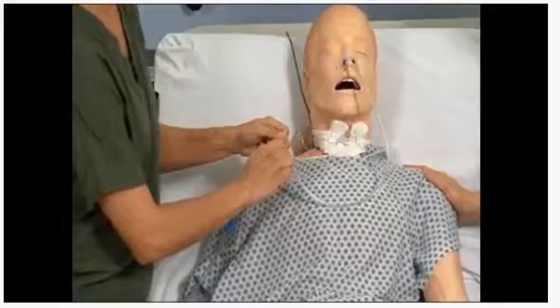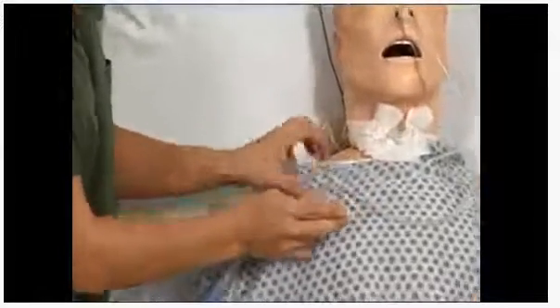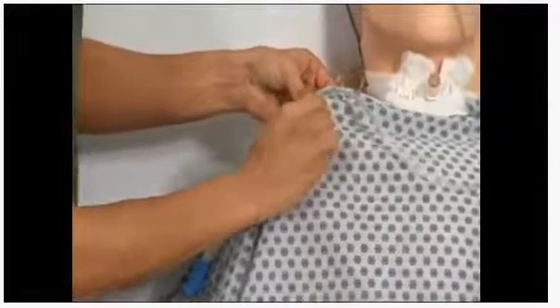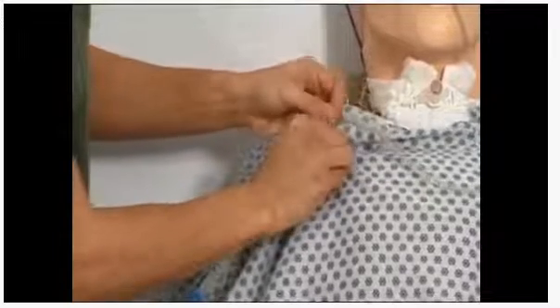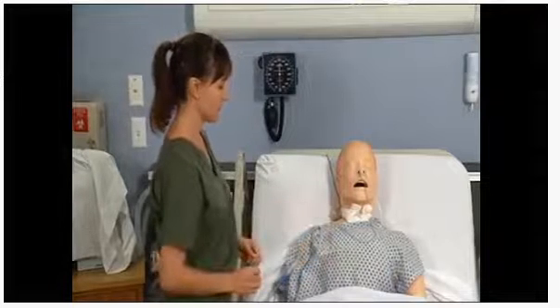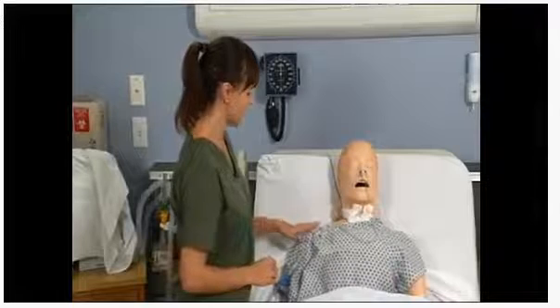And I'm going to get my safety pin, and through the tape, not the tube, I'm going to safety pin to the gown. Okay, Mrs. Jones, I've secured your NG tube to your gown.